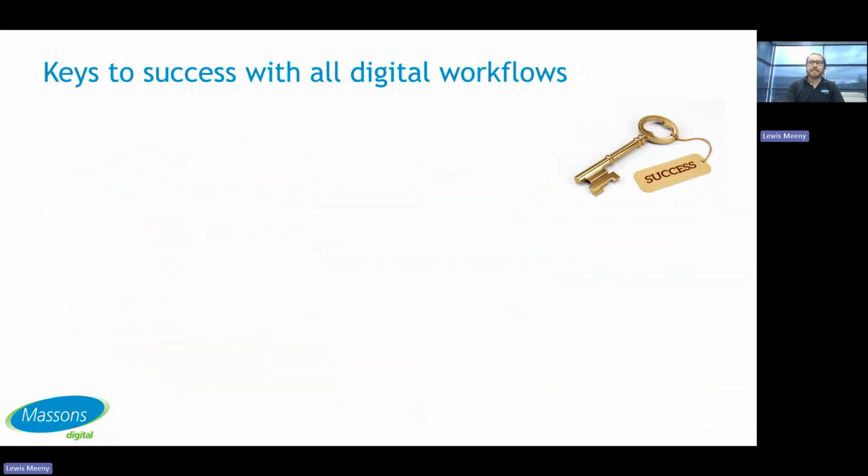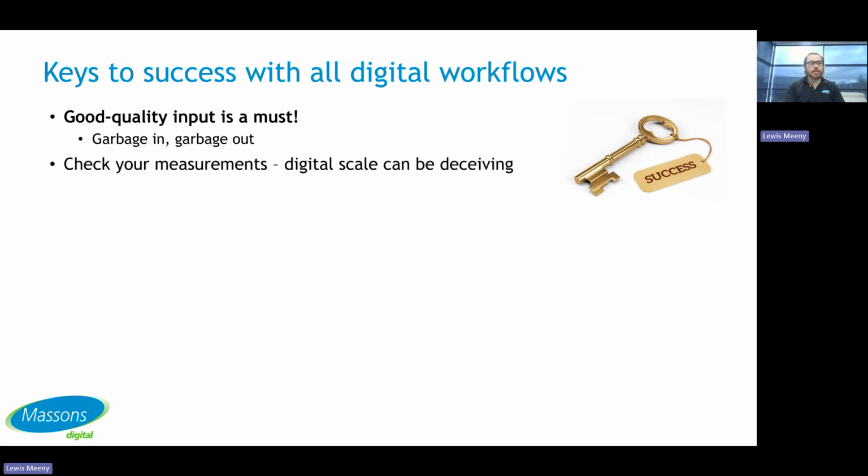So to give you some keys to success with all the digital workflows, reiterating, good quality input is a must. Garbage in is garbage out. We need good input for good output. I always recommend checking your measurements. Digital scale can be deceiving, especially when you're looking on a computer. It can be hard to get a sense of scale, even if you do have the appropriate measurements. So just double check. As I said, take the measurements; rather have them and not need them, than need them and not have them.